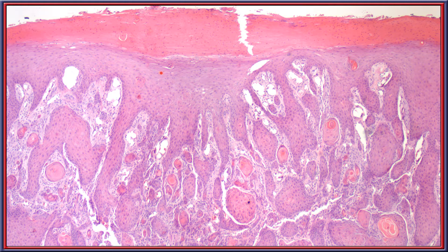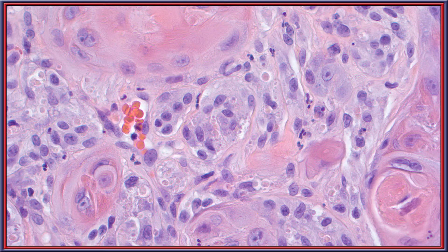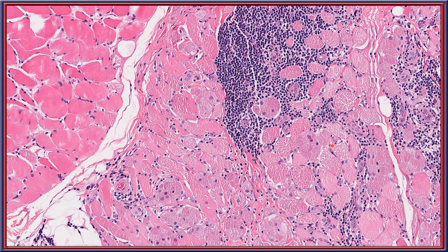There is a remarkable surface squamous pseudoepitheliomatous hyperplasia that extends all the way down to the base of the lesion, making the neoplastic lesional cells quite hard to identify. On higher power, the squamous epithelium is still present, but myriad eosinophilic granules are present in the cytoplasm. At the advancing edge, involvement extends into the adjacent skeletal muscle, and the region of granular cells remains easily identified.